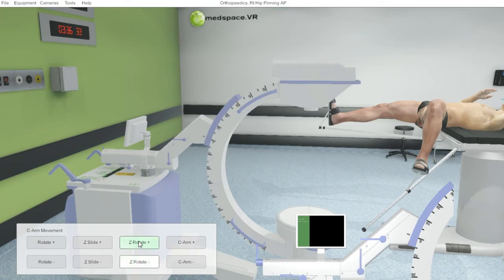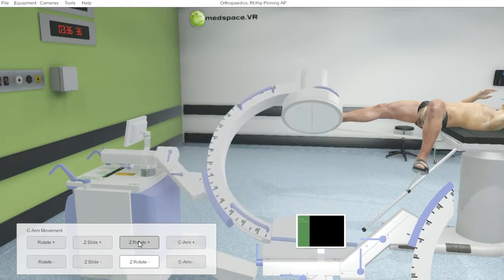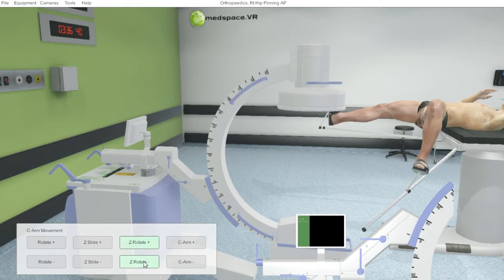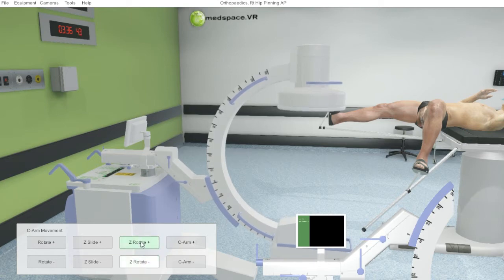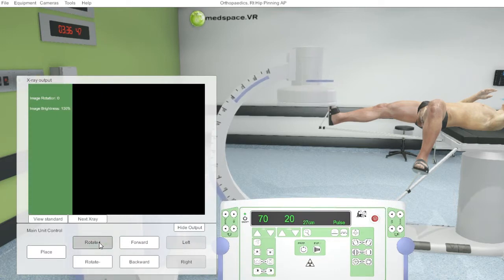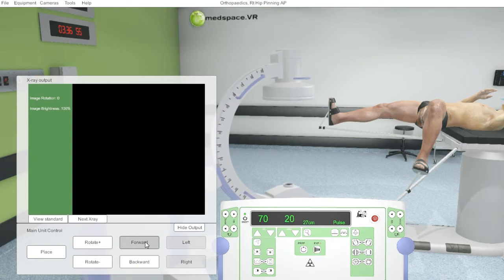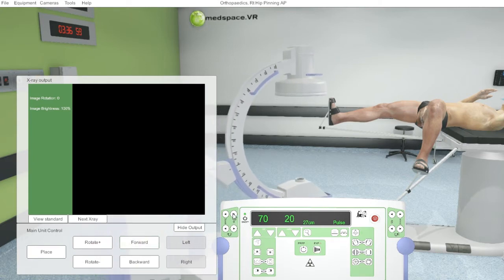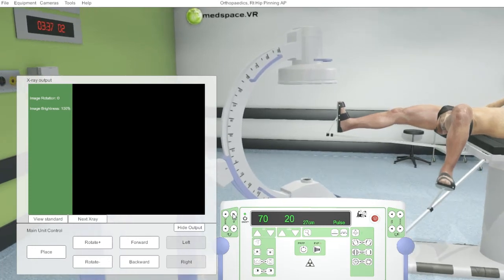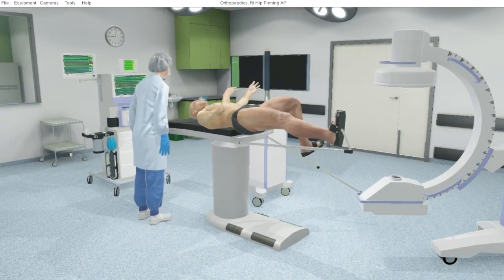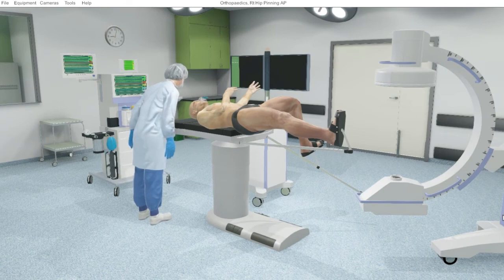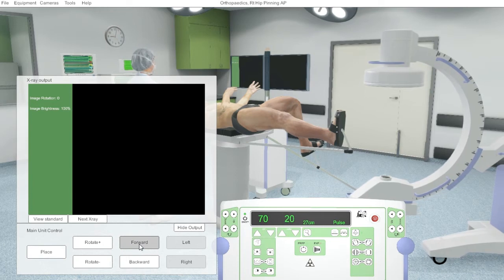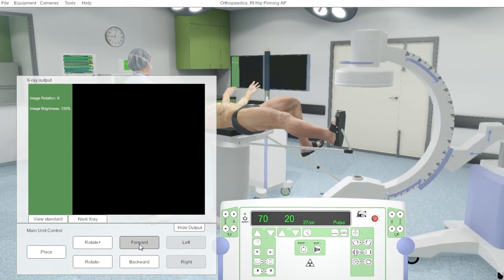The C-arm can be manipulated by using the locks on the actual arm itself, or on the base there's height adjustments and the base movements. You can move the entire base forward. As you can see, the actual handles on the base are in the direction of the movement. Otherwise, you can click those handles sideways and then you will enable left and right movement.